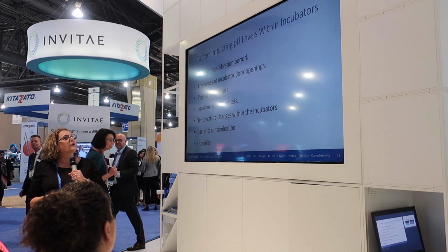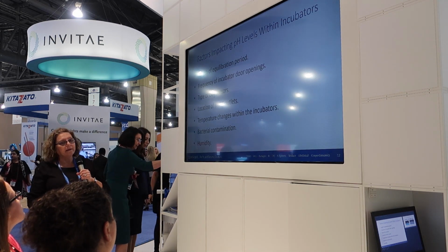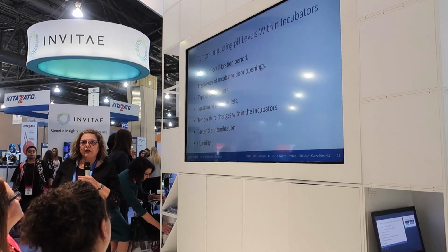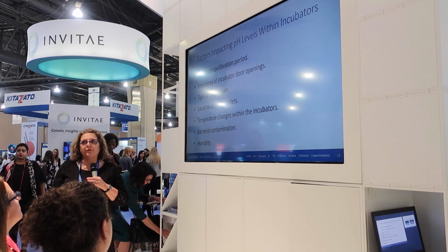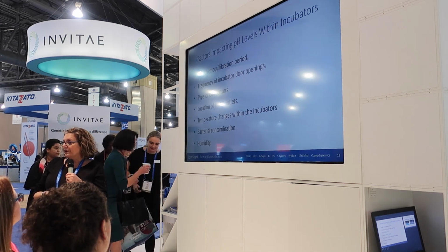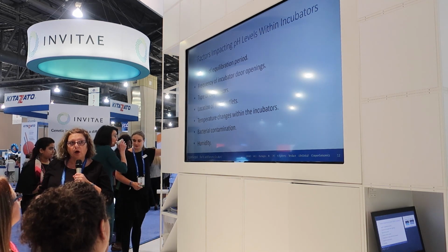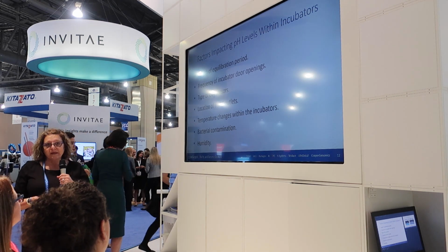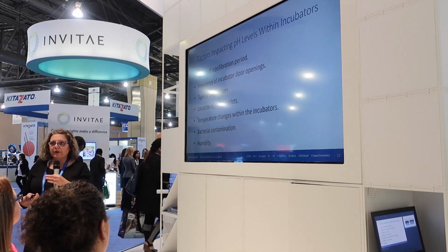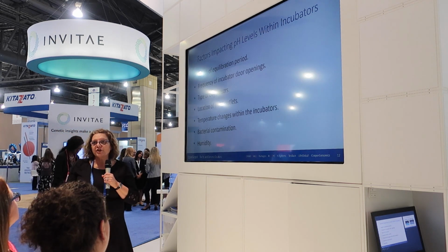Factors that will impact pH within your incubator: we're looking at the length of equilibration, so you really need to be sure that you put those dishes in for a long period of time. How often do you open your incubators? If you don't have enough incubators in your laboratory, you could be opening them quite often. The type of sensors that you have: you need to be aware that not all incubators have the same type of CO2 sensor. Where is your HVAC?